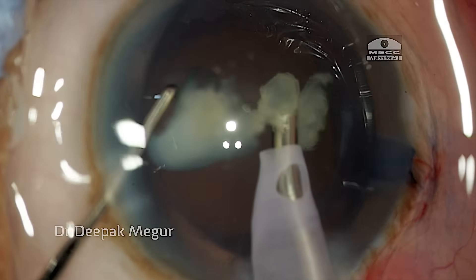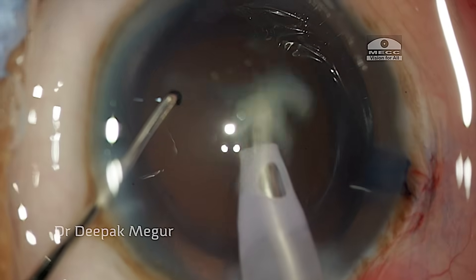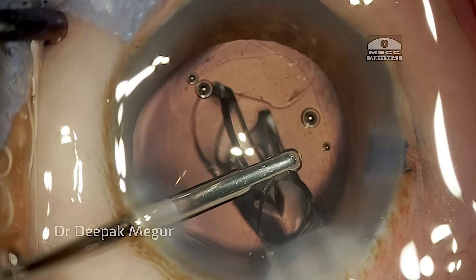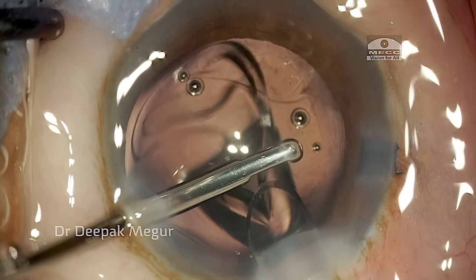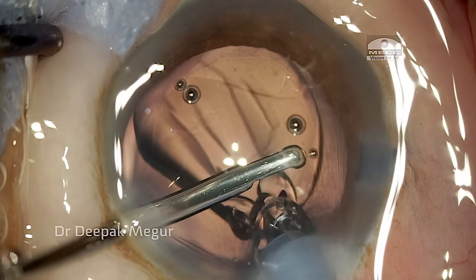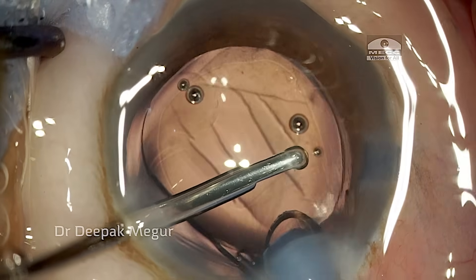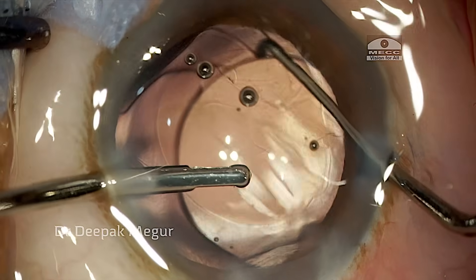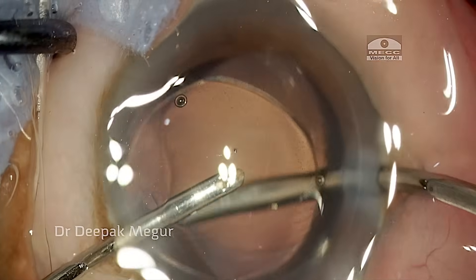The final nuclear fragment is being emulsified. I'm implanting the single-piece hydrophilic lens using the hydro-implantation technique, where the bag is kept inflated by the irrigating fluid coming from the cannula. The lens is gently dialed into the bag — the case is done.